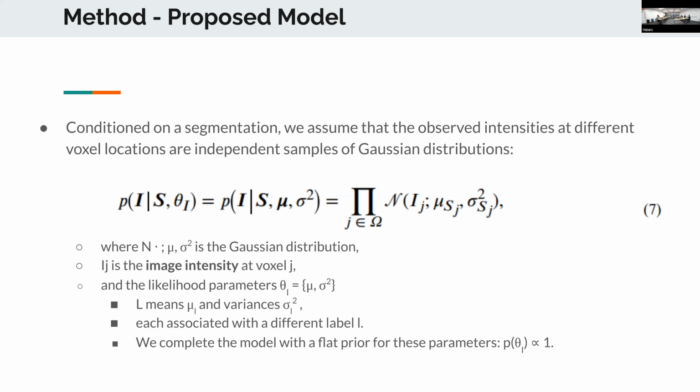Yeah, that's what confuses me. They sample continuous probability values. They actually build, in the code, they use the TensorFlow normal distribution object, and then they do a probability sample for each voxel.